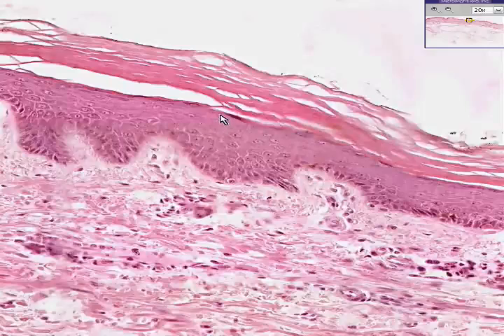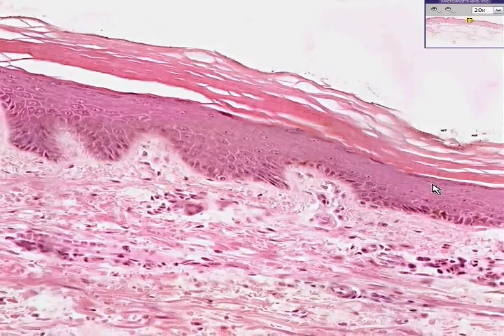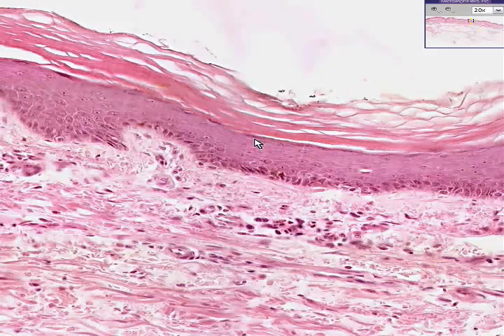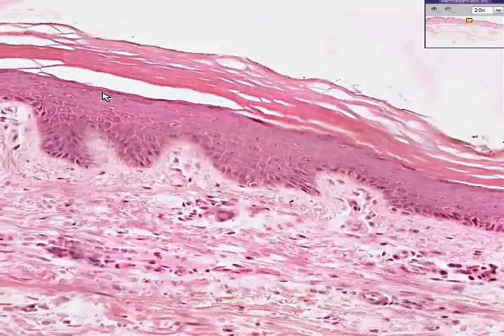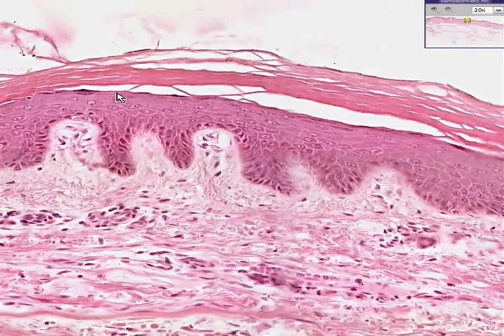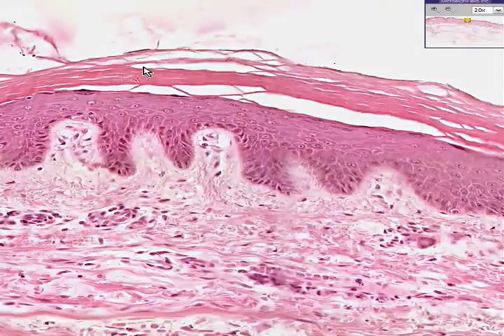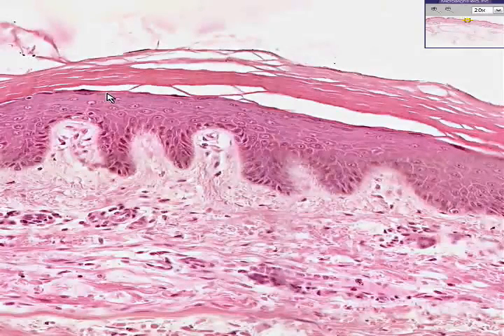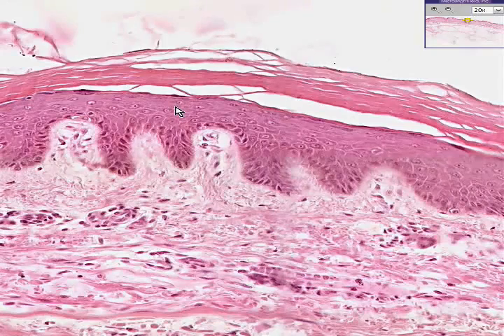Towards the top, you can get cells often, and sometimes in some areas more than others, in which you could see granules of keratohyalin. So that's called the stratum granulosum. And in addition, in some areas of the body, but not this one, there will be a very clear zone, approximately like this, called the stratum lucidum, because it's very clear, before you get into the stratum corneum. So here's a stratum corneum. This might be a good case for stratum lucidum, which is very thin and lucid or clear looking. Here is the stratum spinosum. And if I said spongiosum before, that's just my Alzheimer's kicking in.